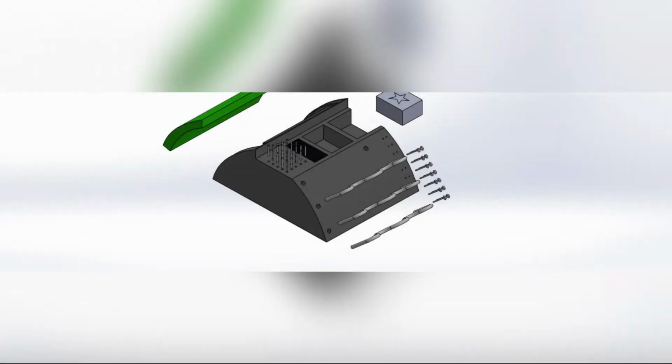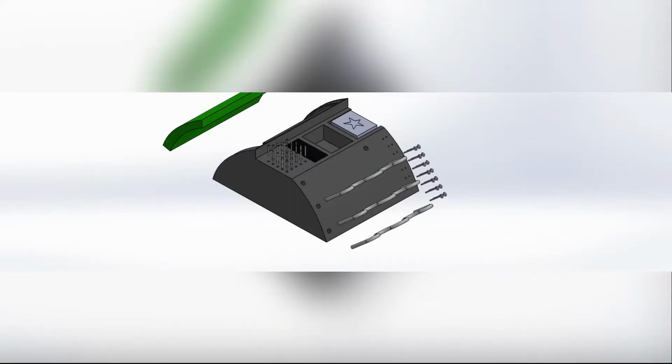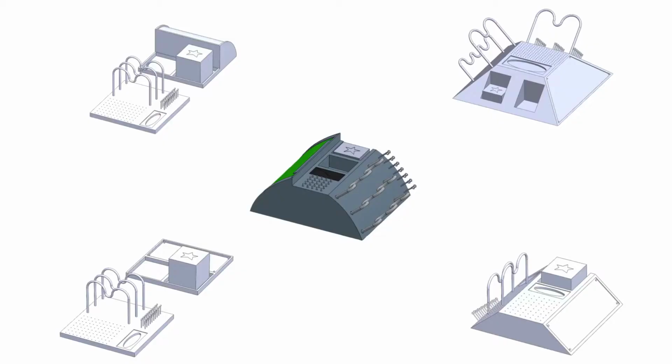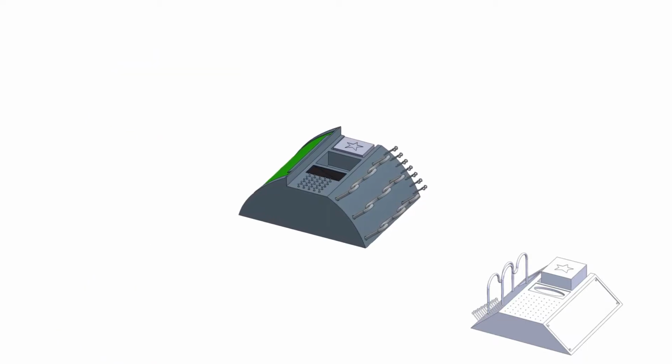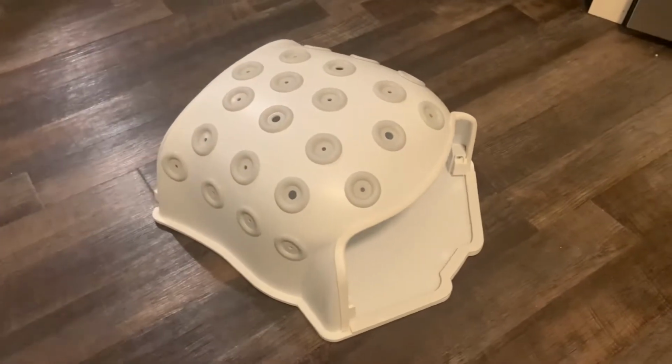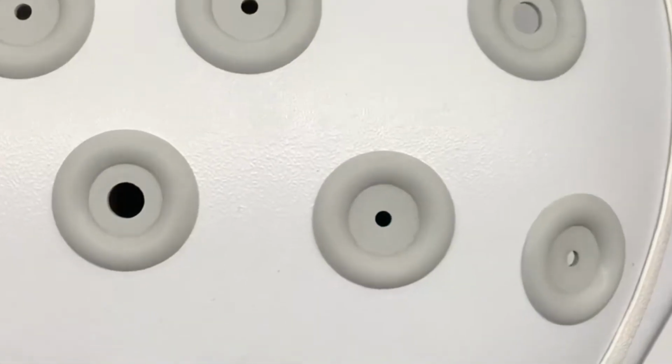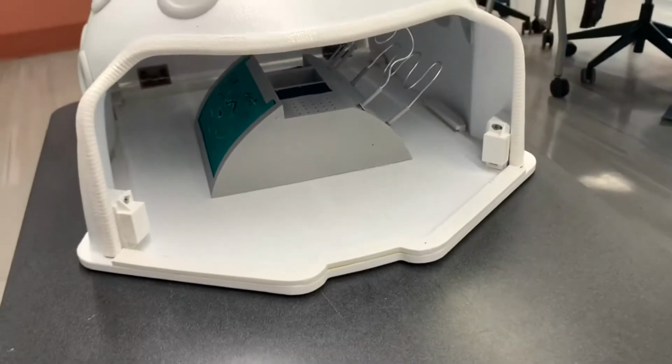We designed a total of 5 exercises, including shape cutouts, knot tying, ring track, modified O'Connor test, and nonlinear cuts. These exercises were modeled into a single 3-dimensional base. This design was selected from 5 prototypes that were presented to Medtronic. It was preferred due to its smaller size, its compactness, and its organic design. The device is approximately 8 by 6.5 by 3 inches to fit within Medtronic's abdominal trainer, which simulates the human torso. The device is easily transportable, so it may be used to test different RAS systems as required.